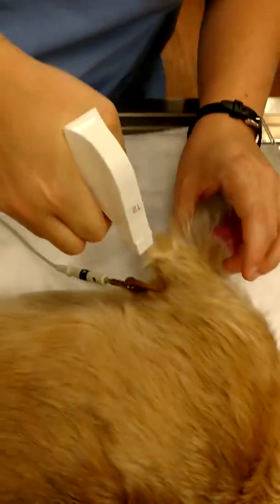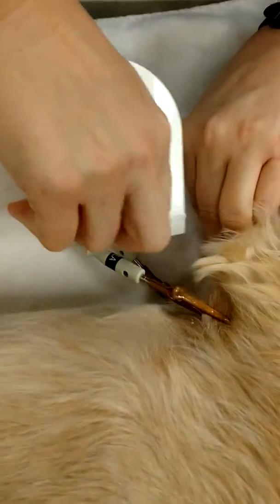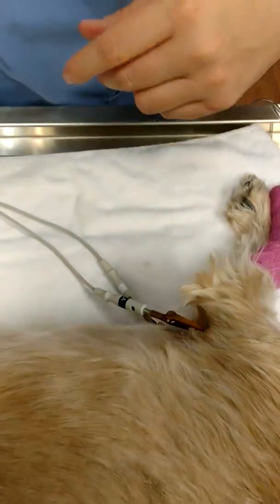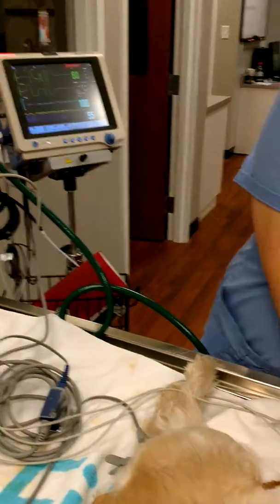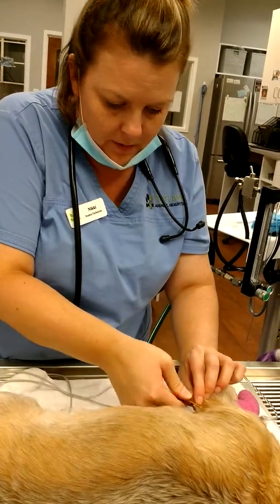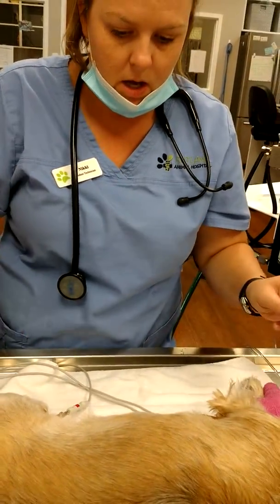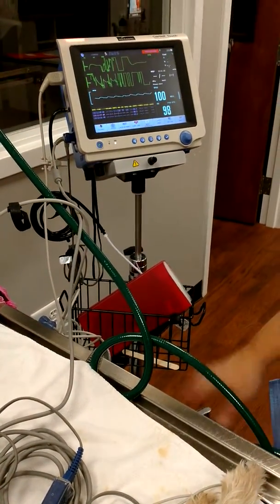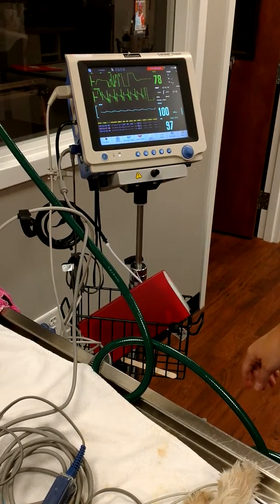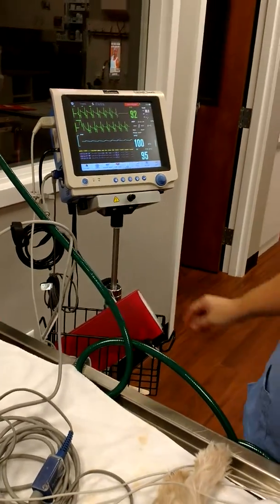So we put them on, and then we're going to apply alcohol to make sure there's good contact between the clamps and the skin. Sometimes you can readjust them. This Cardell tends to double count if you're up against any body wall. So if it's doing funky things like that, they just may need to be adjusted or sometimes they just need a second to read. There we go — we're getting normal electrical activity.